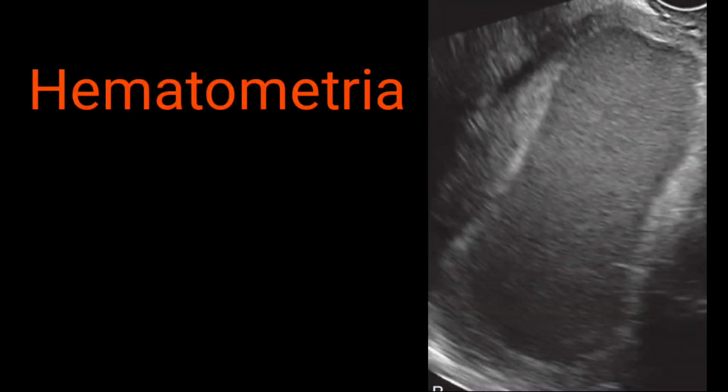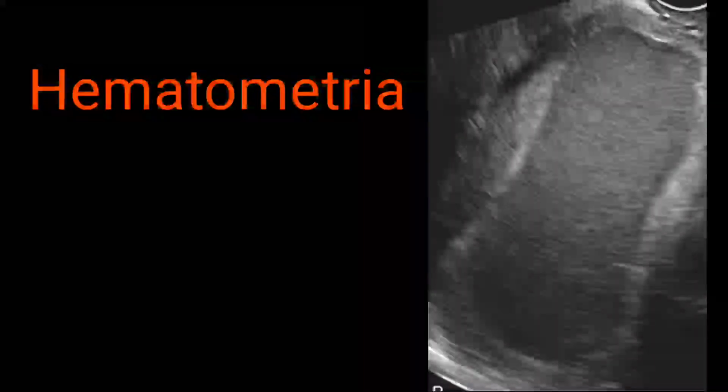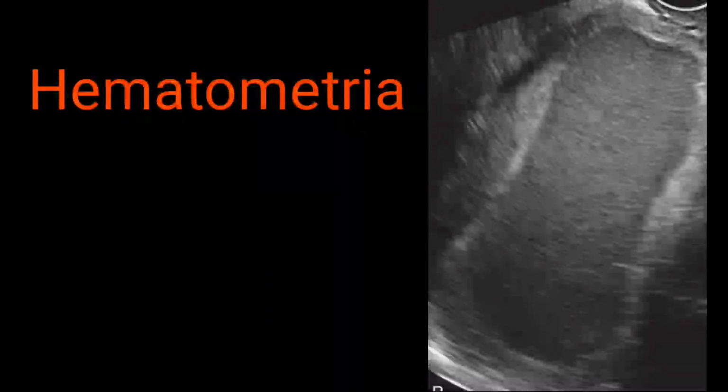Many a time, if you have not seen these cases, the clinician labels it as an adnexal complex cyst, which is not true. You have to be very careful whenever you come across any complex cystic lesion. Always look at the surroundings, whether it is within the uterus or outside the uterus. These are two important findings. You have to be very careful, and this is what you mention on the report for haematometra. Further clinical correlation is suggested.